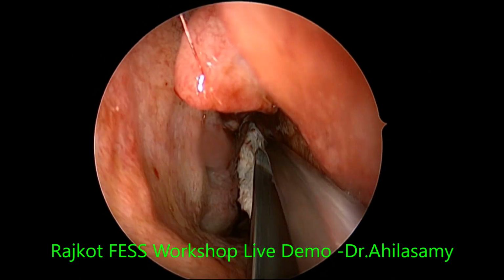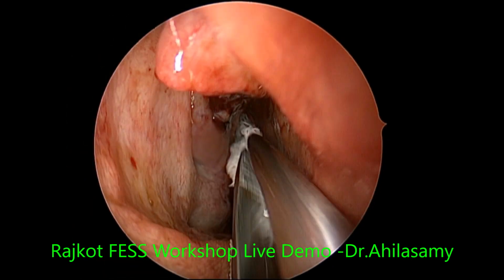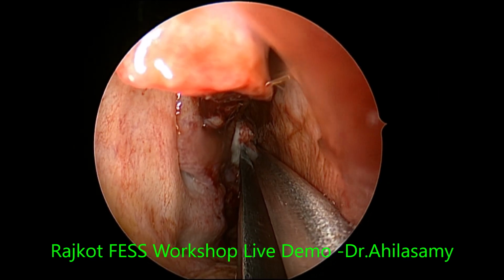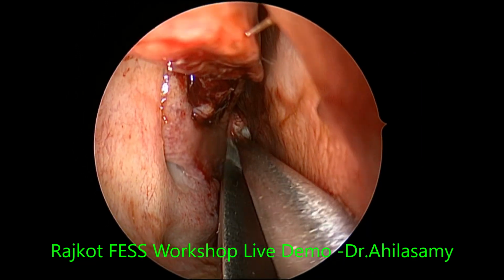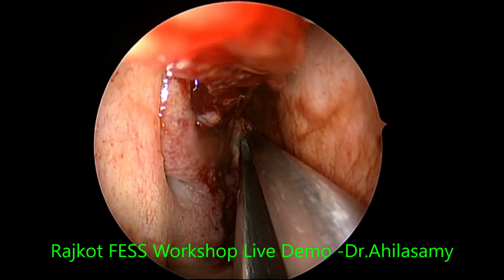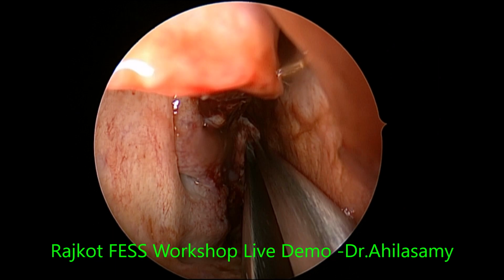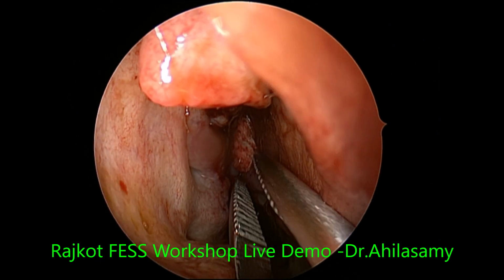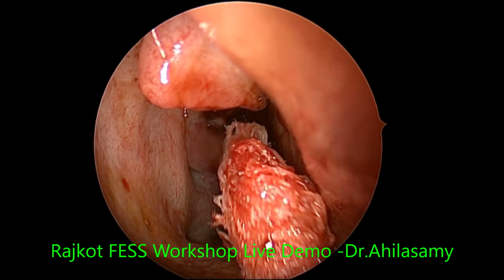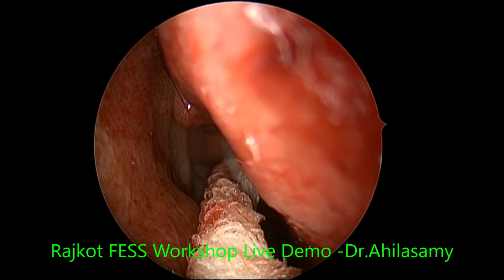So hardly 1 or 2 ml loss. Am I correct? Hardly 1 or 2 ml. That's why I told the anesthetists not to give any IV fluids. They wanted to give, I told them you should not give any fluids because it's a dry surgery, but still they are giving 50 ml mini packs. So this is wet mopping, and don't traumatize the mucosa.